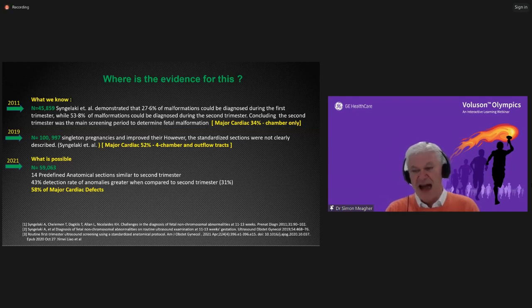Now, if you ask me how and why that's happened, I would say to you that technology plays a role, but probably the greatest role of all is a systematic approach to examining the heart and the belief that you can achieve it. Because in many instances, when you're examining the heart in the first trimester, it doesn't pop up to you in a beautiful four chamber and an outflow tract. You really have to work very hard at it, and you have to be patient because the fetus is quite active and moves in and out of view.